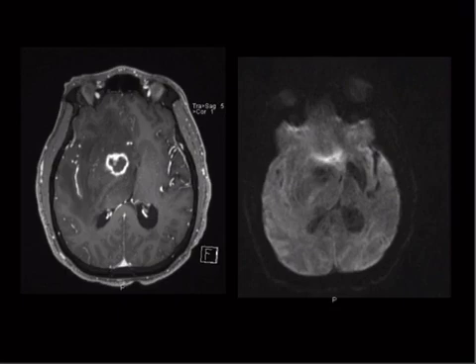This is another stratagem that can be used in multiple choice for these kinds of cases. You got to have a list in your head of the things that restrict and the things that don't restrict. And I'll repeat this throughout all these neurotalks. You get sick of hearing me say it, but I want you to be able to do this. So when you see a diffusion case, I'm showing you that for a reason. It's to help you eliminate distractors. You don't have to actually know what it is sometimes on multiple choice. If you got 4 choices, you can eliminate 3 of them, then you know it's the other one.